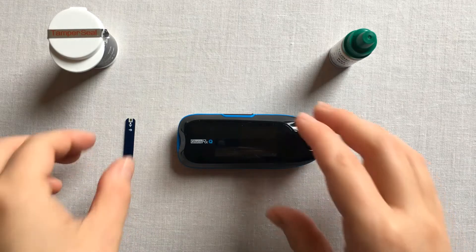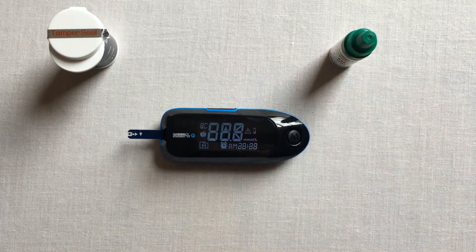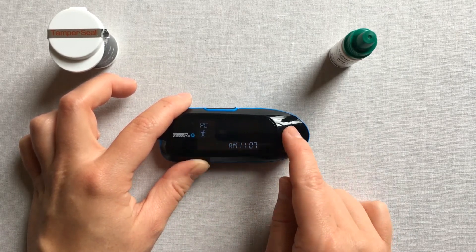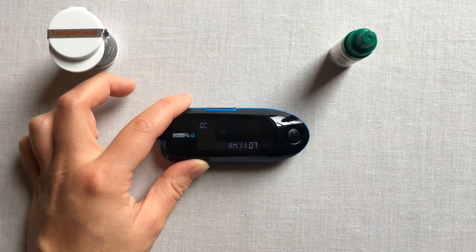Insert your test strip into the meter and wait for the flashing blood sample on the screen. Select your meal marker by pressing the main function button until the QC symbol appears on the screen. Then put your meter down.